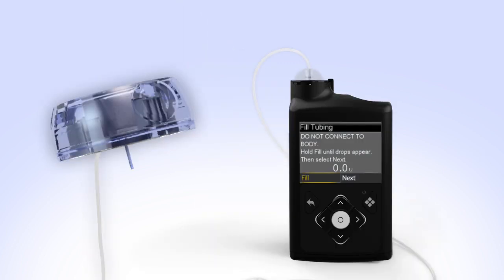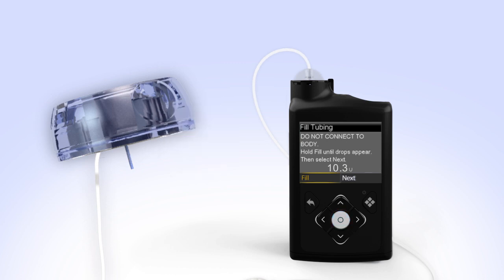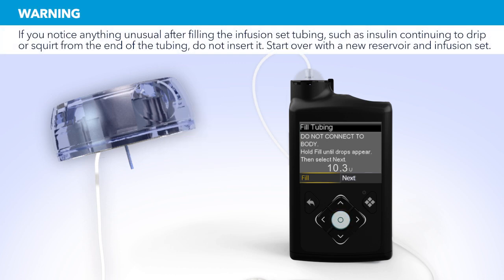Hold the set so that the needle is pointing down. With Fill highlighted on the screen, press and hold Select. The pump screen will display the amount of insulin being moved through the tubing. Continue to hold Select until you see insulin drops coming out at the end of the needle. After you see the drops, release the Select button. Hold up the tubing to the light to check for air in the tubing. If you see air, once again press and hold Select until the air exits the end of the tubing. Now press Right and select Next.